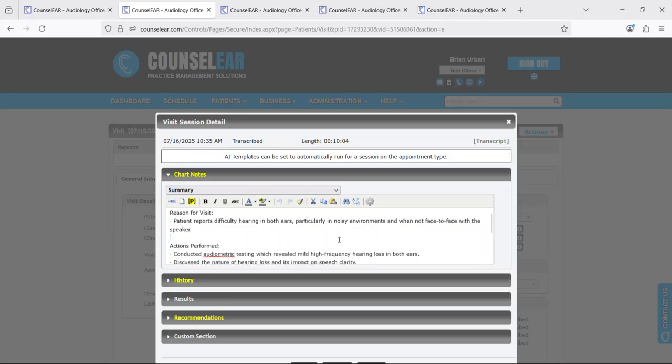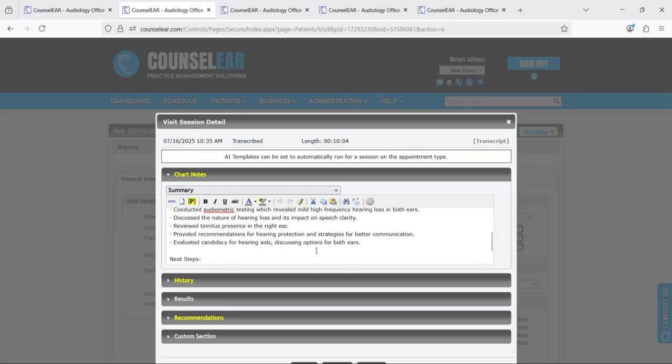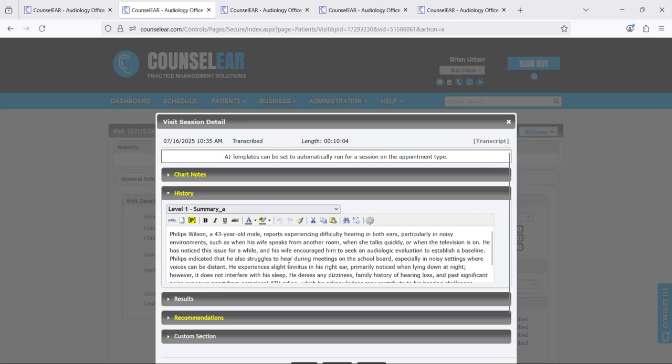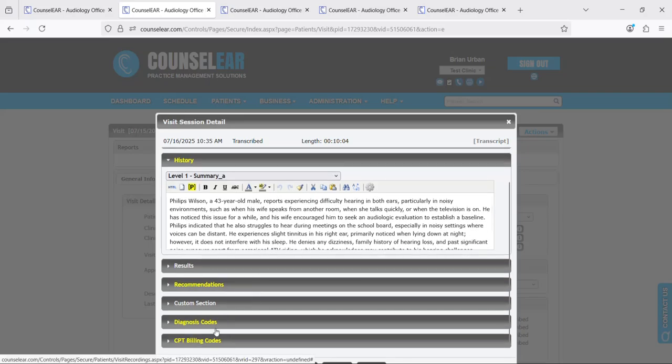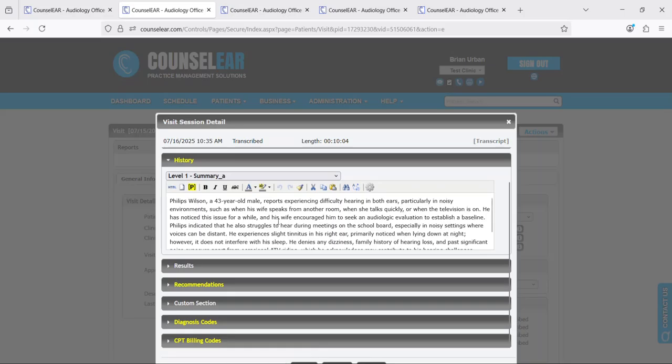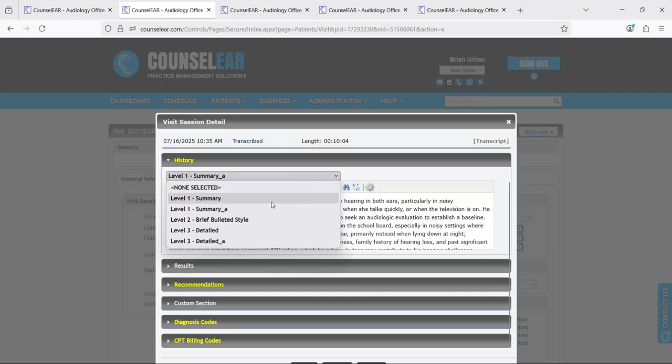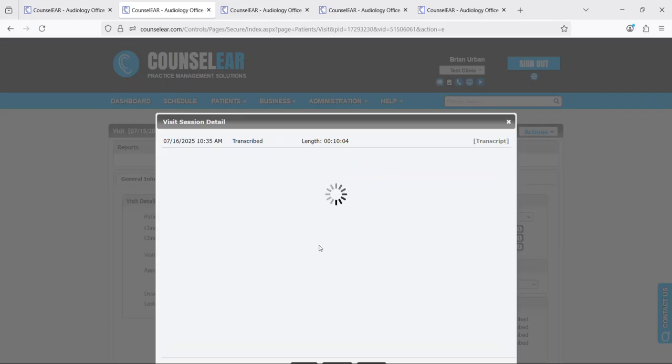Now we'll show in a little bit here how you can manage your AI templates. But point being is very quickly that transcript turned into AI generated text. Same thing goes for history, same thing for results or recommendations or diagnosis codes or CPT codes. You can go through and you can generate that information very quickly.